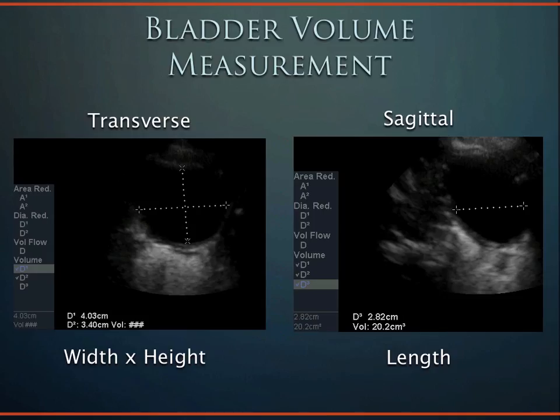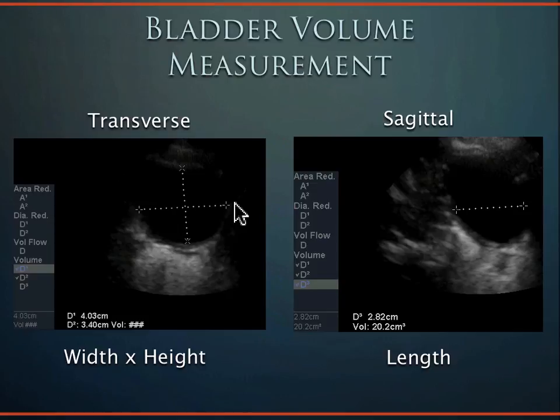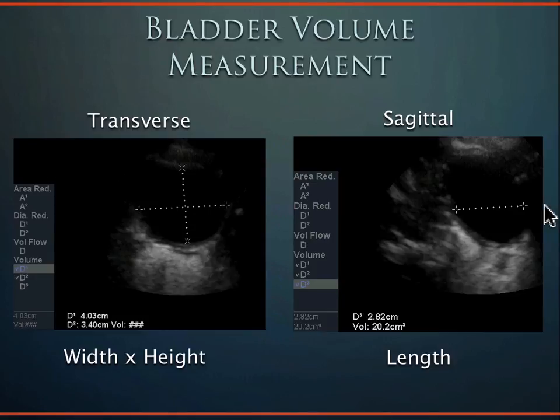You can estimate bladder volume using the equation: width × height × length. In the transverse plane, measure width (patient's right to left) and height (anterior to posterior) with calipers. Then unfreeze, rotate to sagittal plane, and measure the length — note that what appeared as width in transverse now appears as length in sagittal. Multiply all three values for the volume. Some machines can lock in values and calculate automatically.